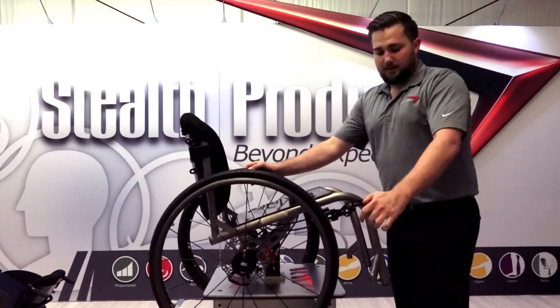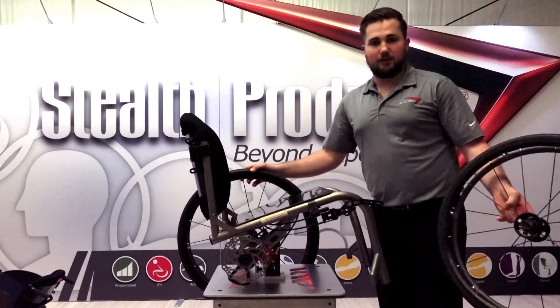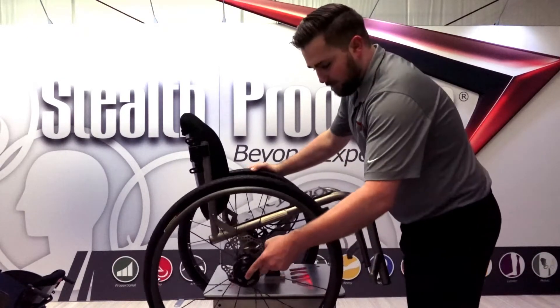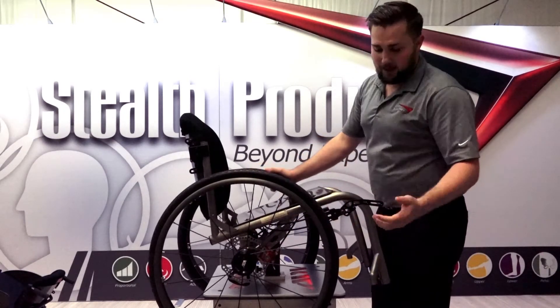A nice benefit of this lever is that whether locked or unlocked, you still maintain quick-release capabilities of the tires. This is a major advantage for those who transfer themselves independently and are in and out of their car multiple times a day.